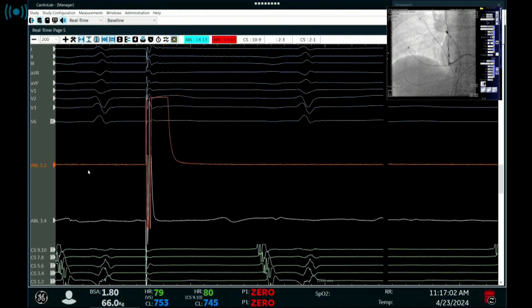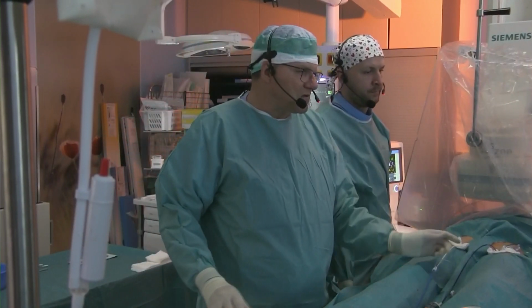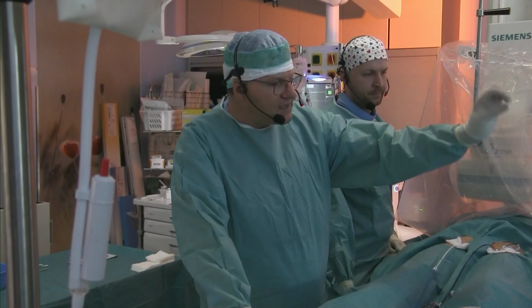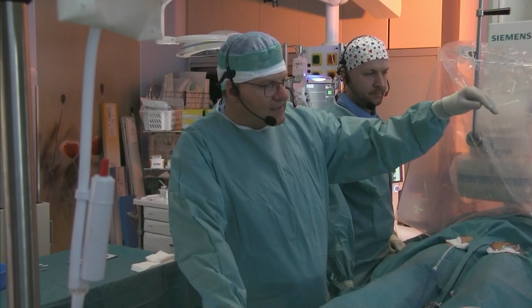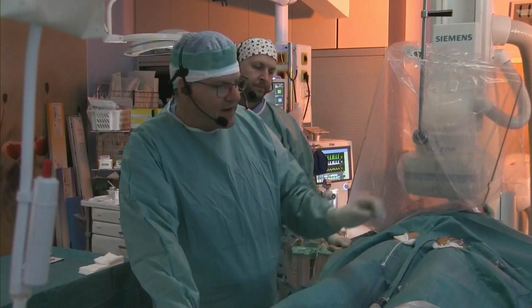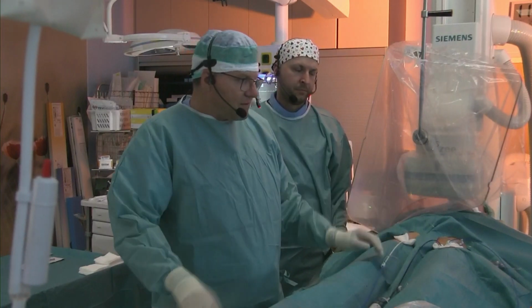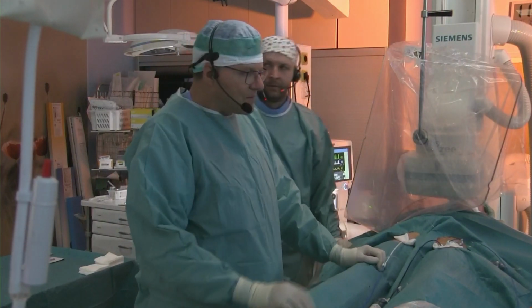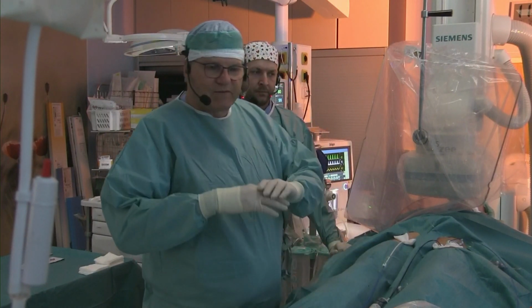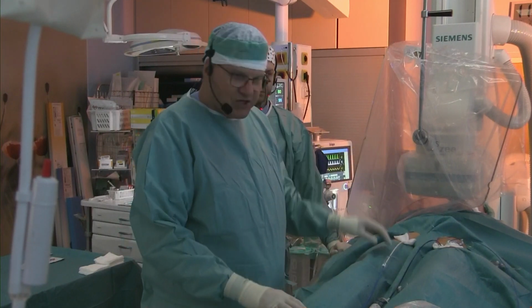Okay, all right. So there is still non-capture, and maybe the last lesion was half an hour ago, because not only this circular lesion around the SVC was critical for phrenic damage, but also this intercaval line, because you see that there are some phrenic nerve capture sites, even if it was with 20 milliamps with high energy and very weak capture.